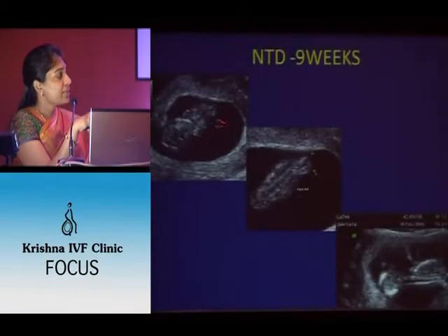This is one of our cases. At 9 weeks, we could see there is abnormal curvature. I was not able to take a proper CRL because the posterior aspect was not at all regular. The repeat scan at 11 weeks showed the nice kyphoscoliosis of the fetal spine.